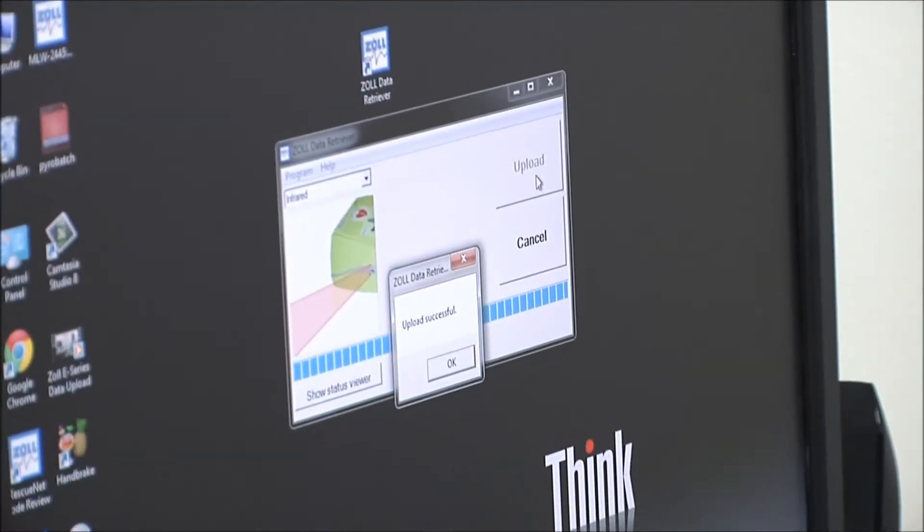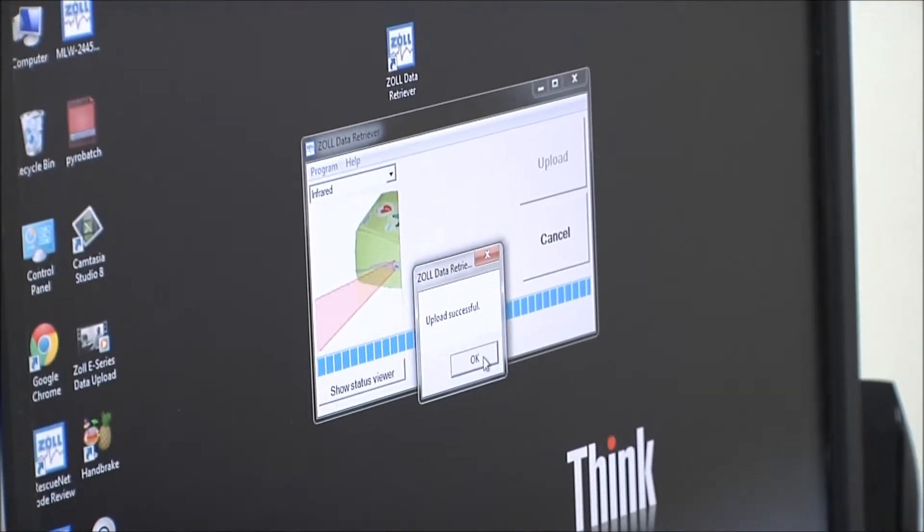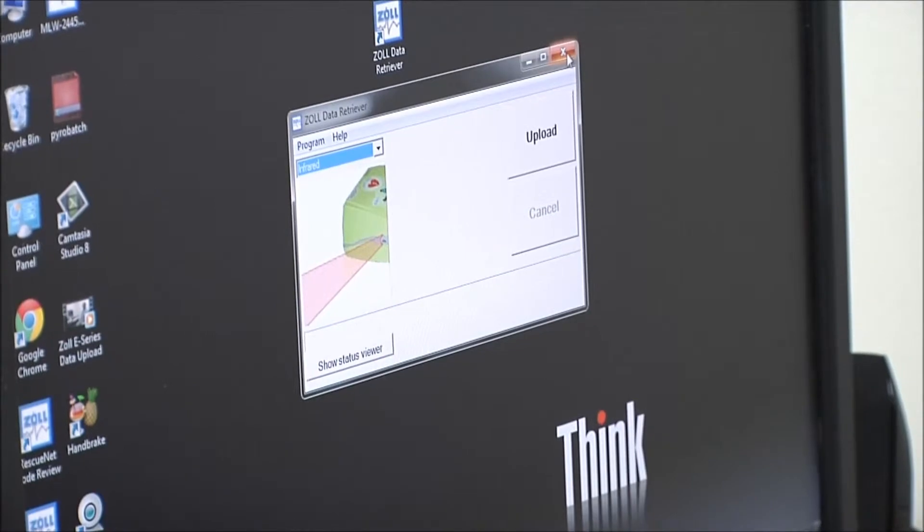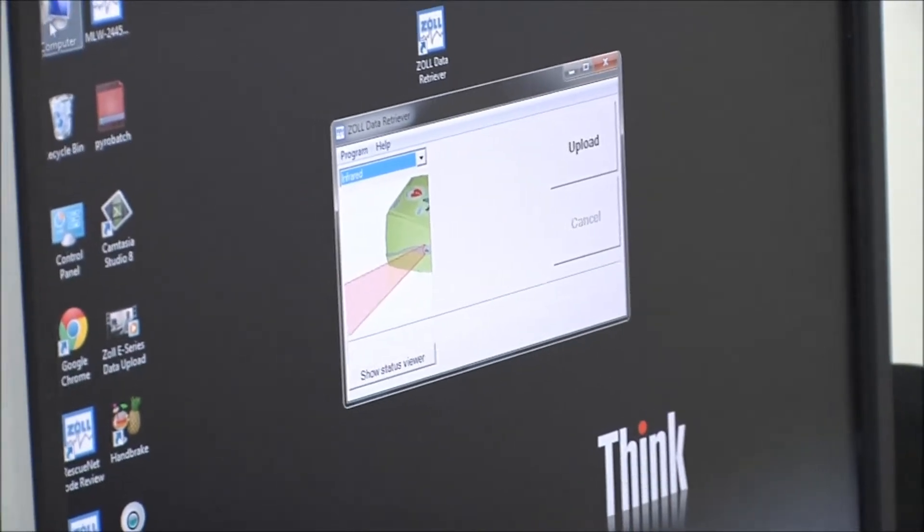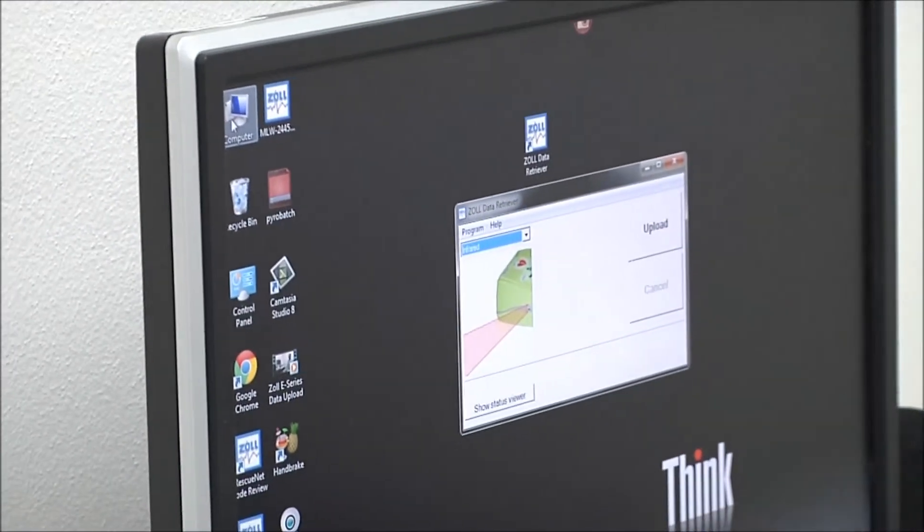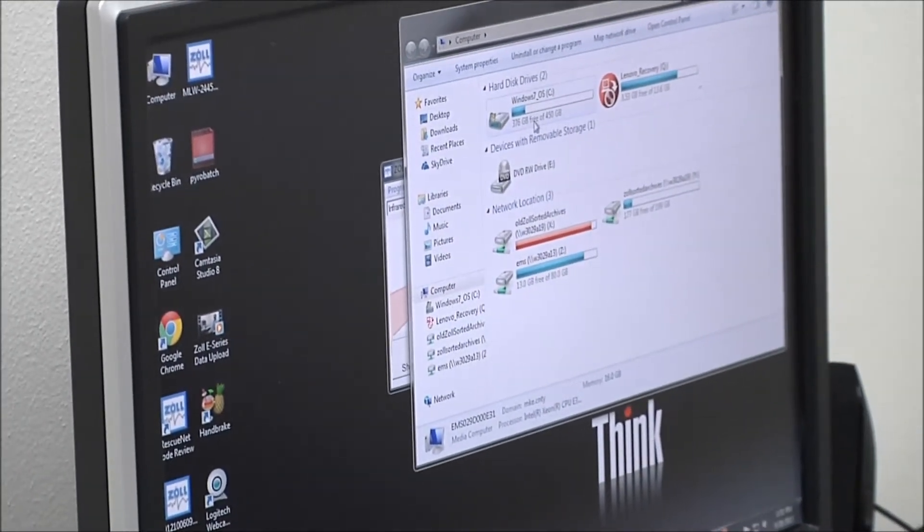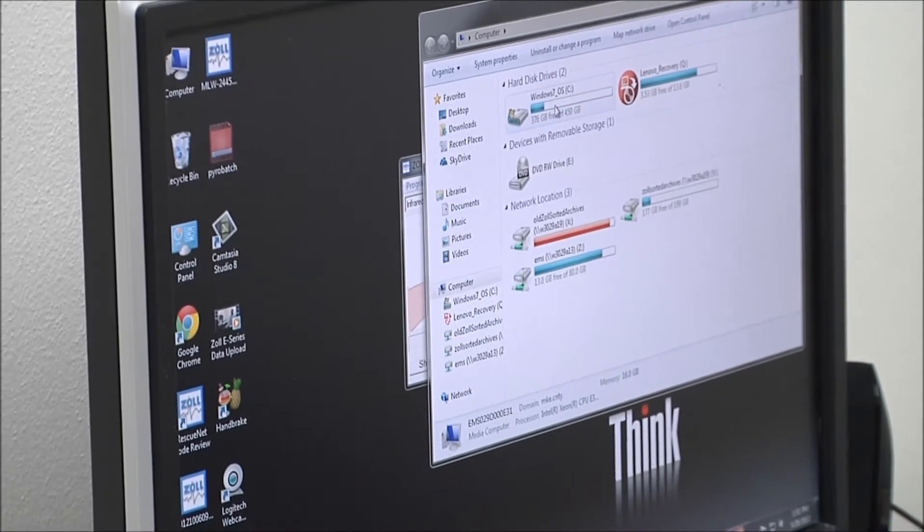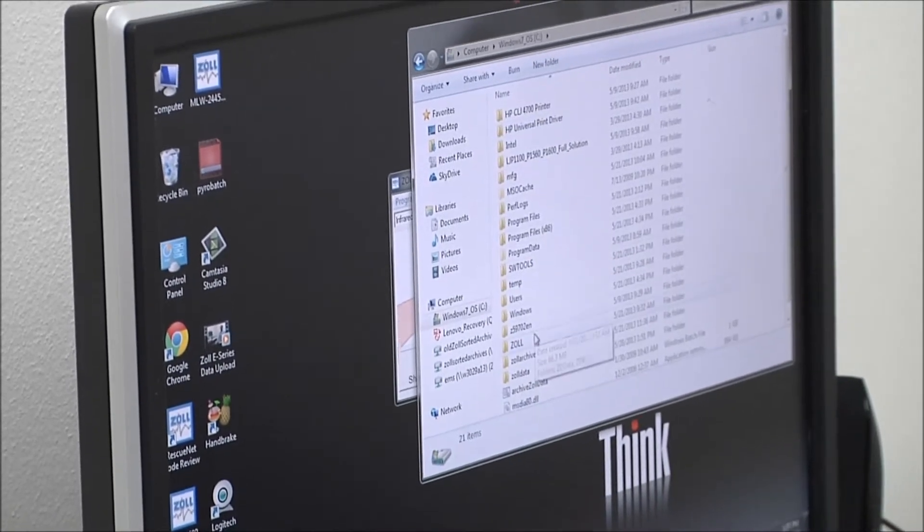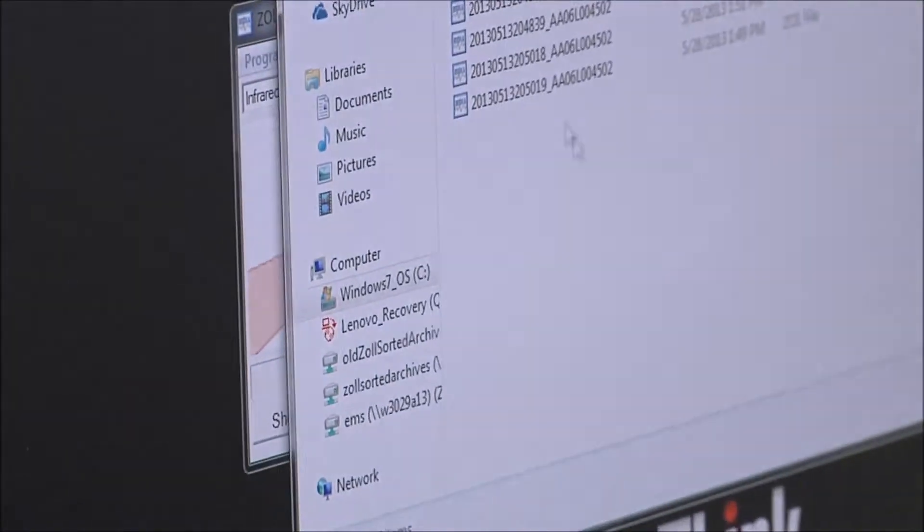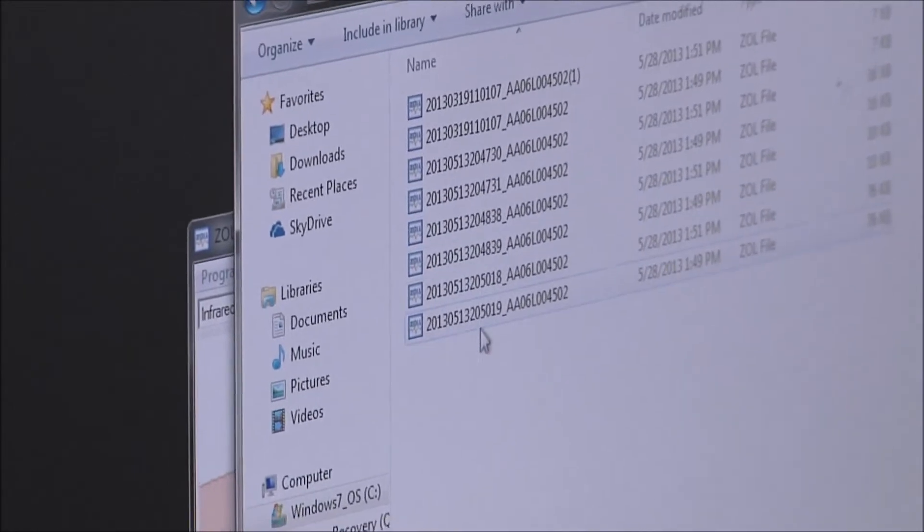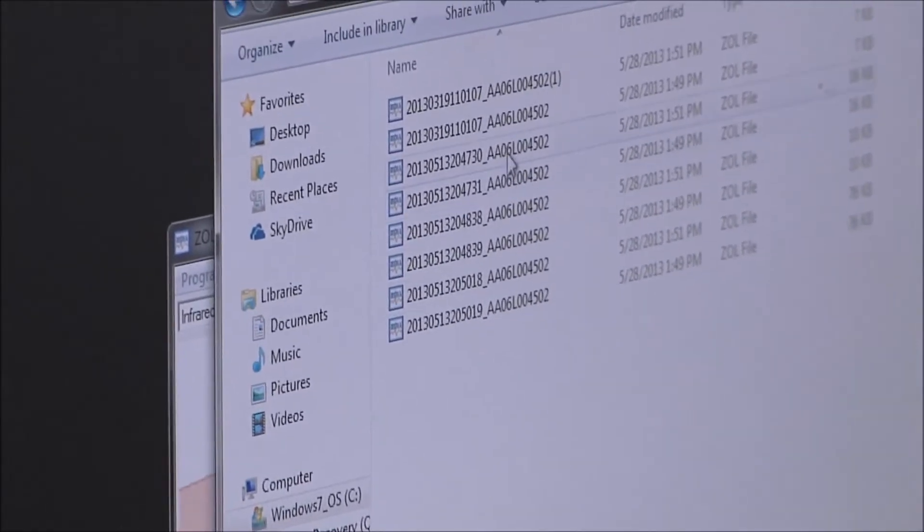So then we get an upload successful message. And if we want to, we can go in and check to make sure the files are there. All these files are put into my computer, the C drive, in a folder called Zoll Data. So we go here and we can see that all these cases have just been uploaded.